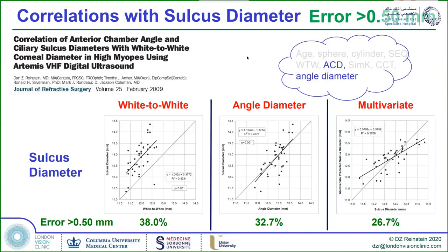And of course, I'm going to underline what I said earlier again. This is a very forgiving procedure because in a particular eye, you might be okay with a 12.6 or a 13.2. It's just that you'll get a vault of 400 or a vault of 650, and most of those would be acceptable within the eye. But I'm going to come to later why a power user might want to choose whether to leave a 600 vault or a 400 vault. And of course, that's out of the question in a system that depends on this level of accuracy.